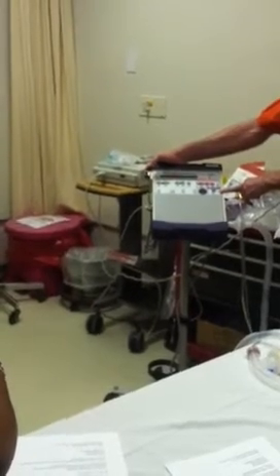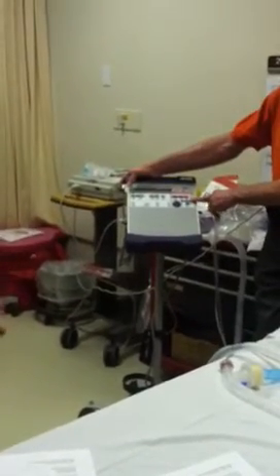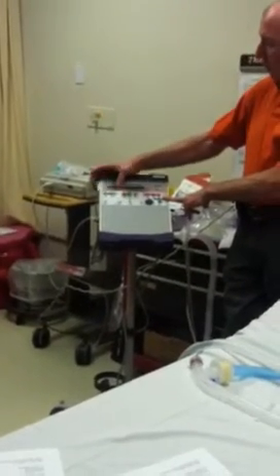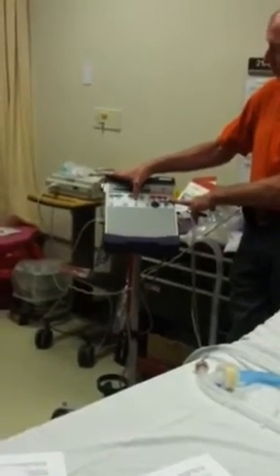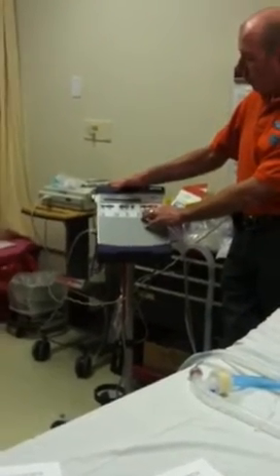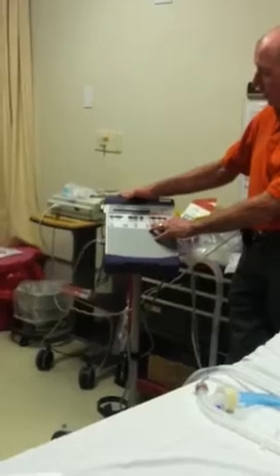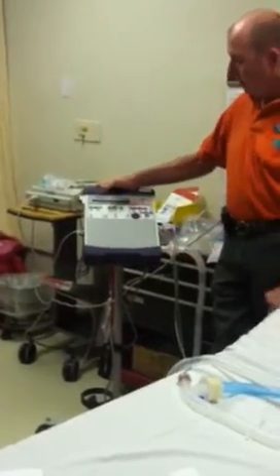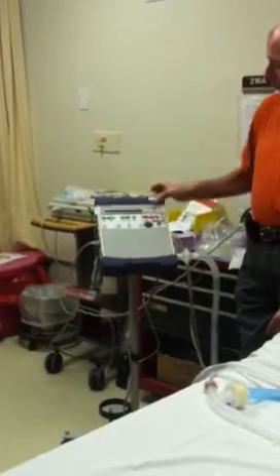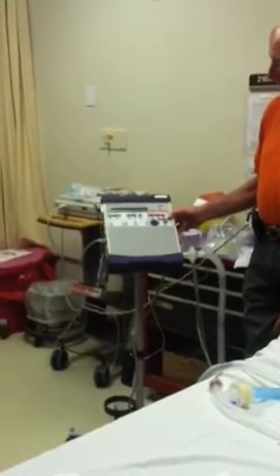That's for real severe patients. So now I've switched them over to SIMV. Now we have pressure support, so we can change that pressure support to increase it to 15 if we need.